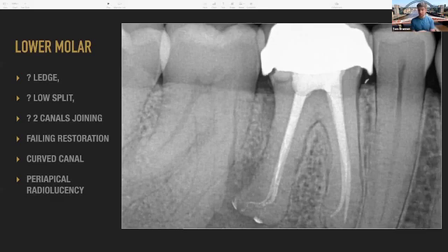And again, the mesials are two separate roots, so it's not joining and bumping together. It's just the fact that they've not shaped it and cleaned it well. So again, I know I've improved on the cleaning, the shaping, got to within that 1 to 2 millimeters of the apex, got all the old material out, placed a good core.